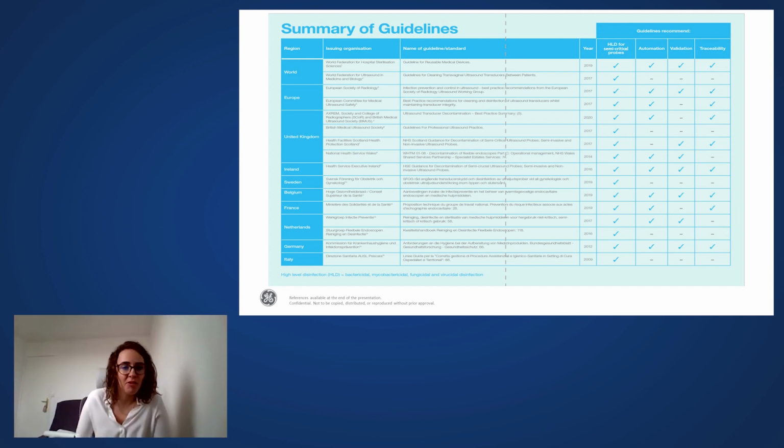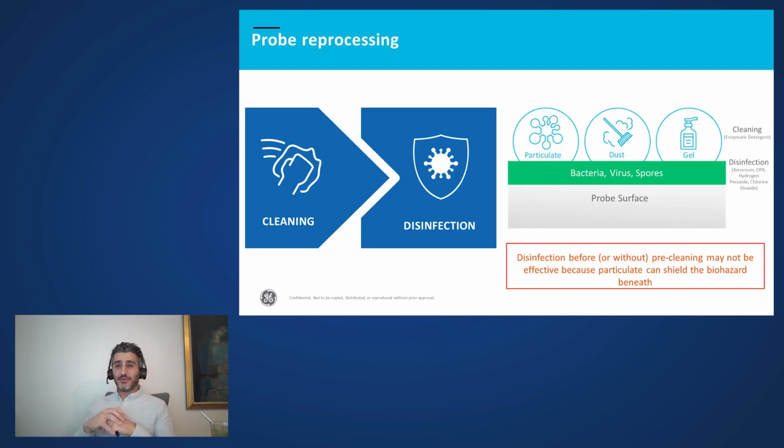Okay, thank you very much, Benjamin. Now that we know more about recommendations and guidelines, I think a very practical question is coming to my mind. How do we disinfect an ultrasound probe? That's a really good question, since there's a variety of ways how you can disinfect your probes.